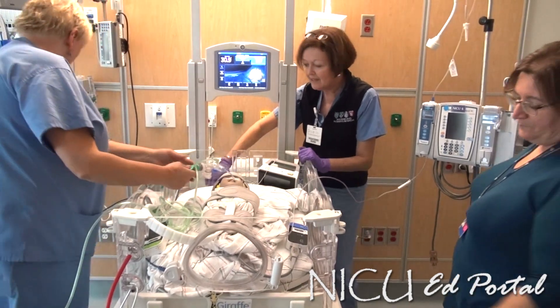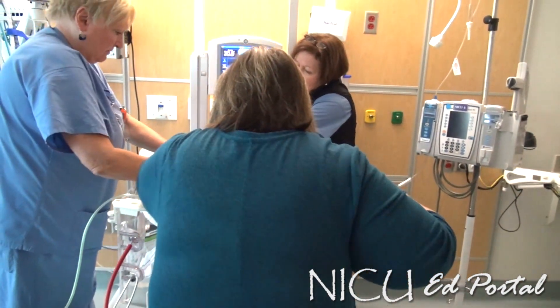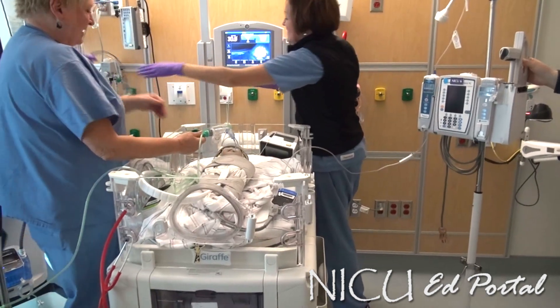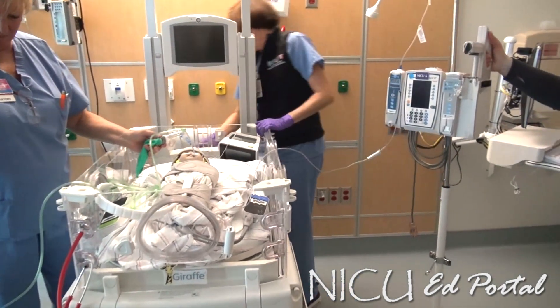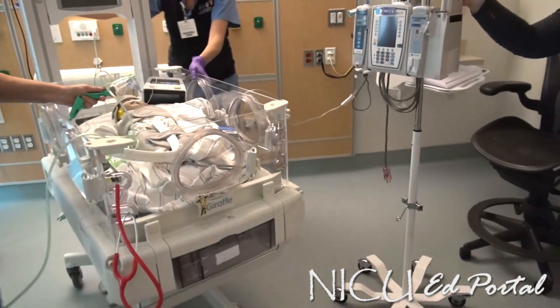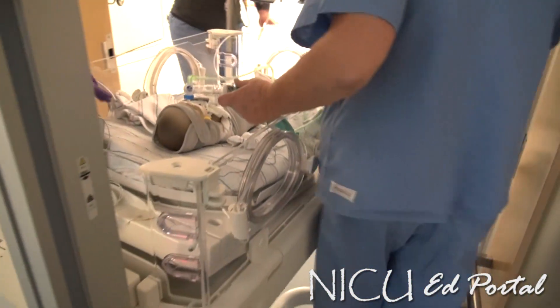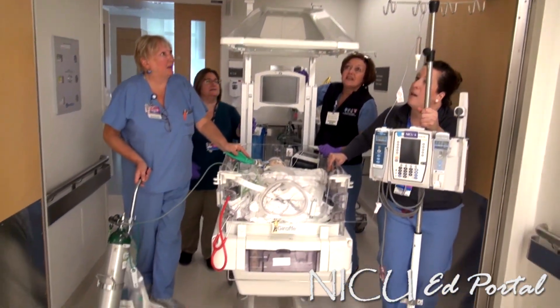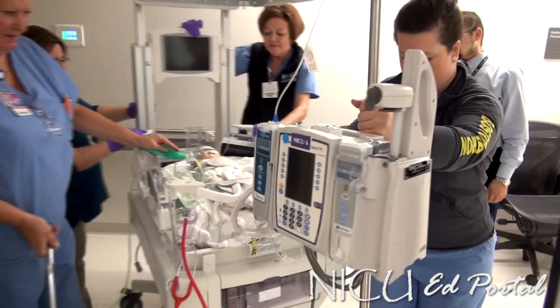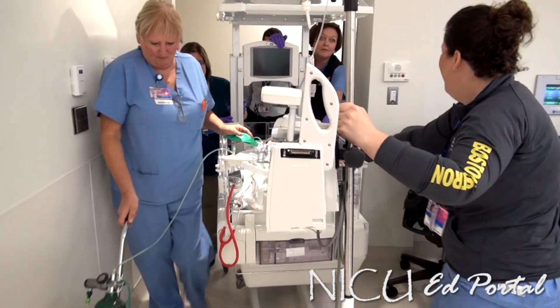Are we ready to go? He's bagging nicely. I'm turning the bed off and unplugging it — we're set to roll. He's sitting at 93% saturation, heart rate nice and high. We left the bed down a little so we'll clear the doorway. His sats are 94, heart rate is 156 — he's sound asleep. We've just cleared that door, which is really important to remember with the bed. Stopping here so someone can take over the bagging while I get the ventilator to put on the baby.